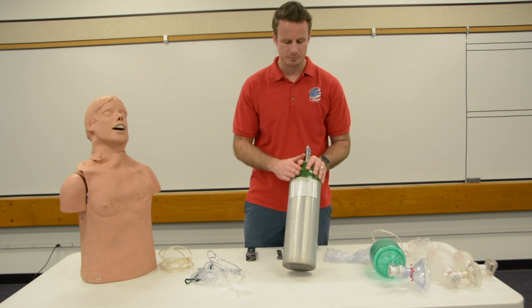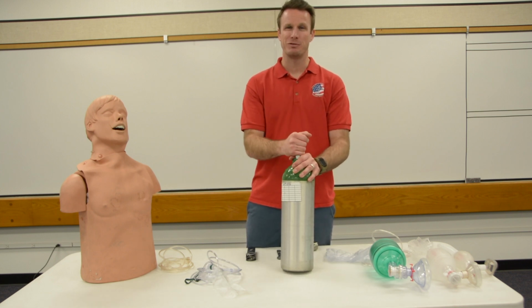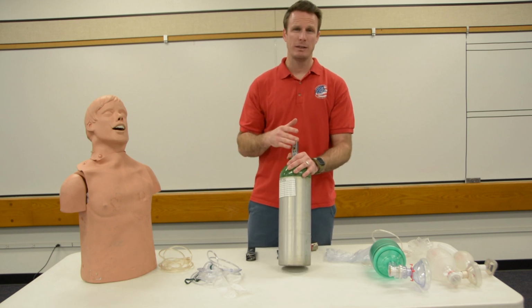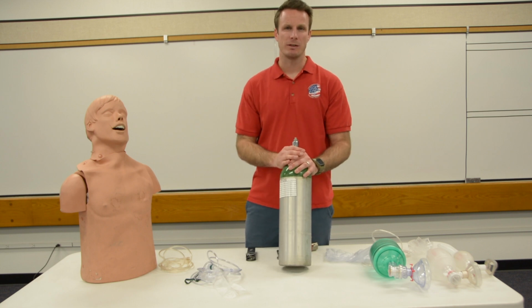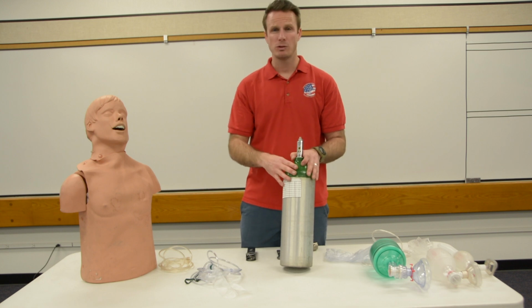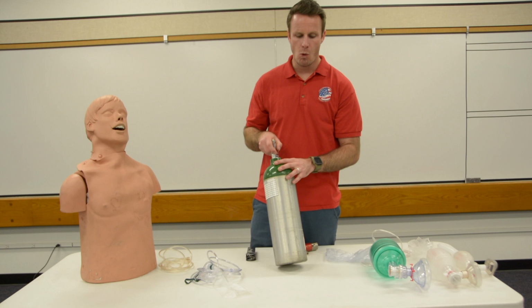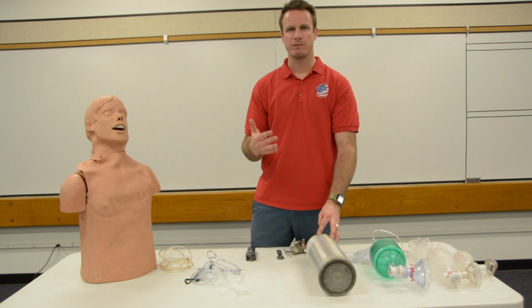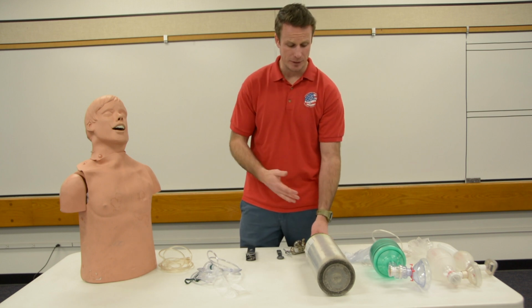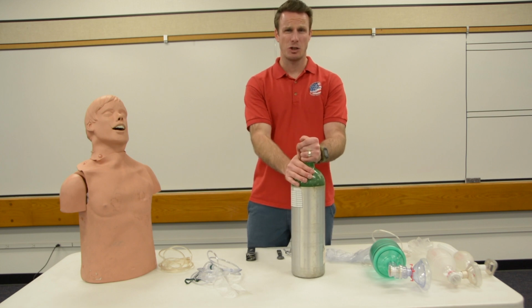So, a couple safety features of oxygen tank: you should never open it up next to a flame or in and around a flame or fire, or any patients who are smoking. Oxygen is very flammable, can cause some major damage to those patients or yourself. And then also, we want to try to keep one hand on the tank at all time if it's going to be standing up like this, or lay it on its side. That way it doesn't fall over, doesn't damage the tank, and potentially cause the tank to become some sort of projectile or missile, because these tanks are charged.